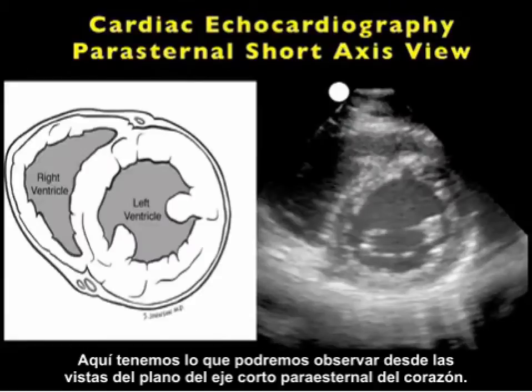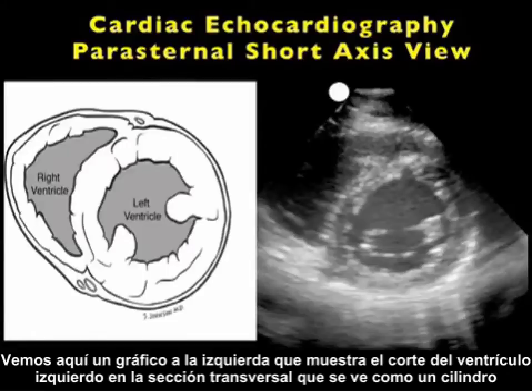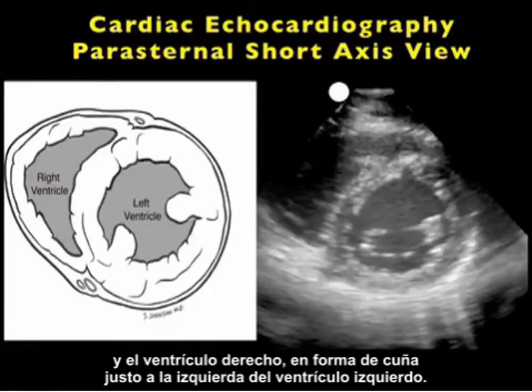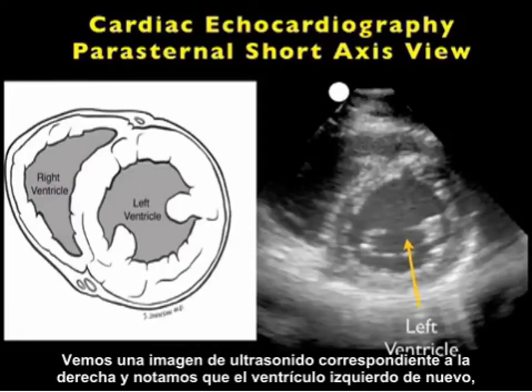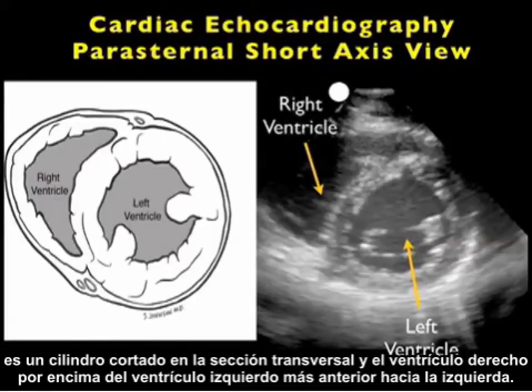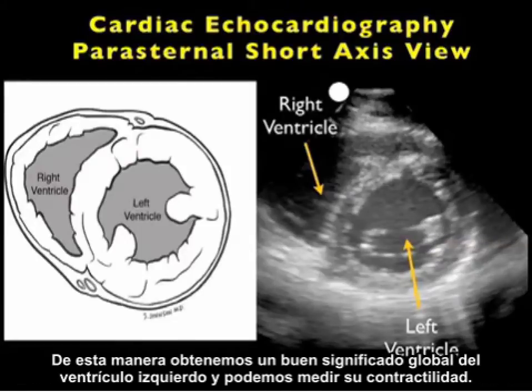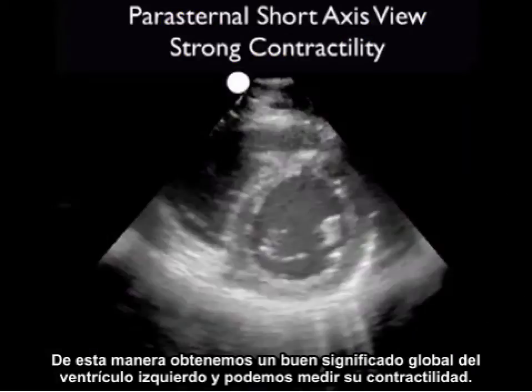Here's what the views from the parasternal short axis plane of the heart will look like. We see a pictorial showing the left ventricle cut in cross section as a cylinder, and the right ventricle is a little sliver just to the left of the left ventricle. We see an ultrasound image corresponding to the right, and note the left ventricle again — that cylinder cut in cross section — and the right ventricle above the left ventricle, more anteriorly and to the left. In this way, we get a good sense of the overall cylinder of the left ventricle and can gauge its contractility.